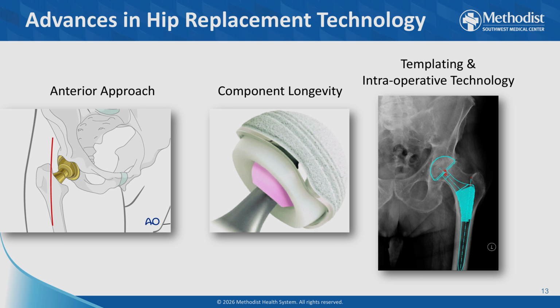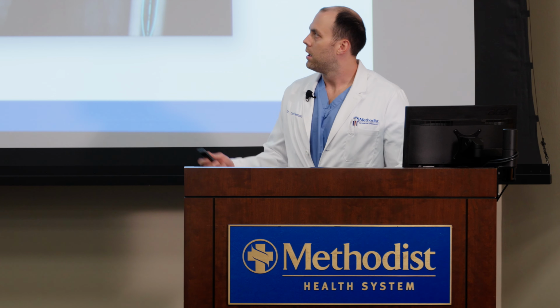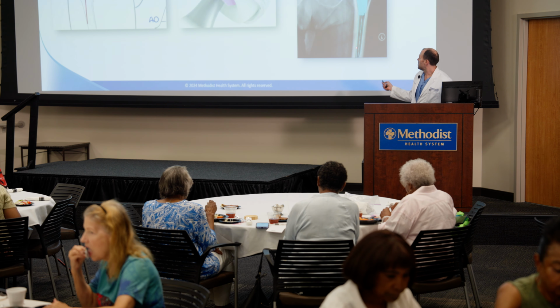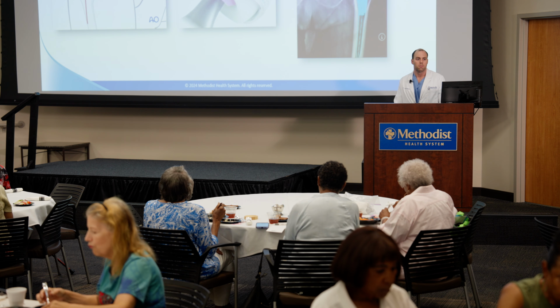And then the last one is intraoperative technology and templating. Before we even go back to surgery, I can tell you roughly within one size or so what I'm going to put into your hip, where it's going to be, and what it's going to look like. I do all of my templating like this before surgery, so you can basically plan it before we even get back to the operating room, which is helpful.